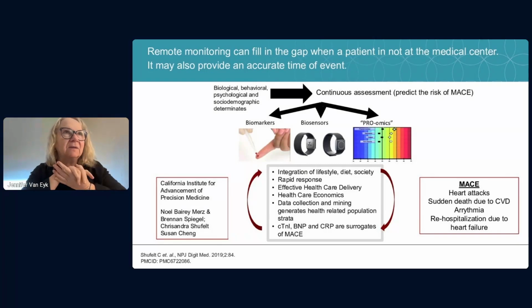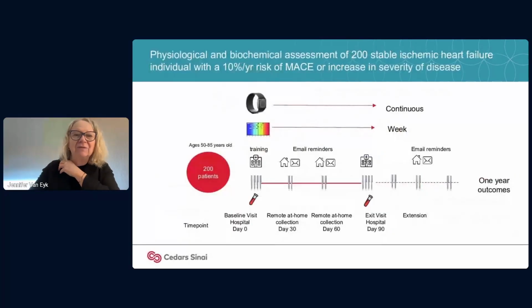And at Cedars, when you come in having already had your first event, you go into rehab. So they're coming in every week for X number of months for their rehab. So we were also able to interact with them if they were having trouble with their remote sampling devices, or to answer questions and work with them to get to a point where we knew that it was going to be a really good uptake. And I think we managed to achieve that.